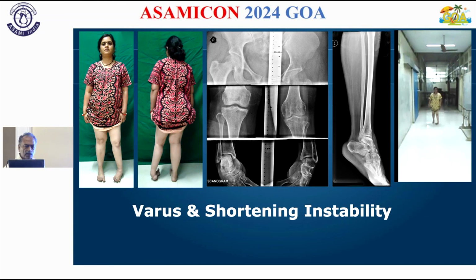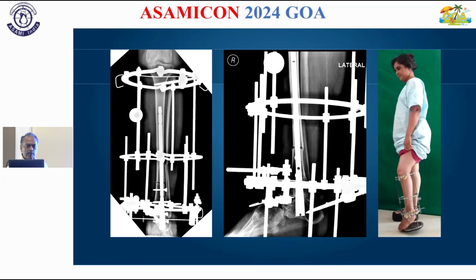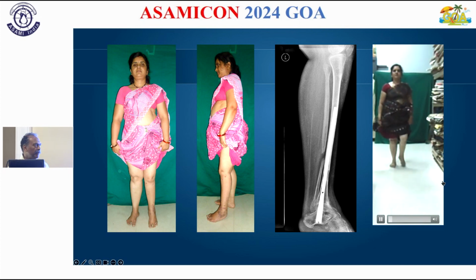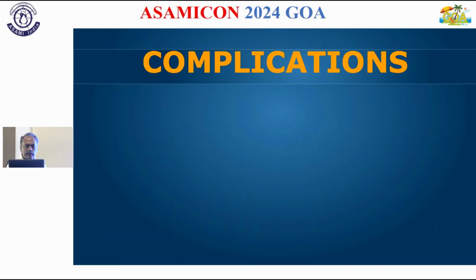We can perform arthrodesis in this lady with poliomyelitis, very severe instability of the ankle. So we have performed this. The nail goes in from below. We fuse the ankle. We perform a lengthening at the distal level to help her get 4 centimeters of length and a much better gait and stability at the level of the ankle. By keeping it in equinus, you don't have to also correct at the level of the knee.